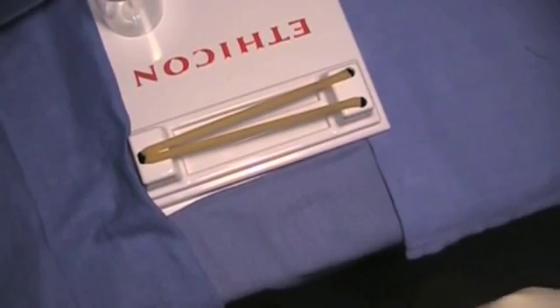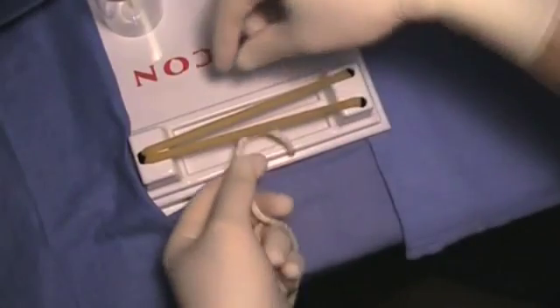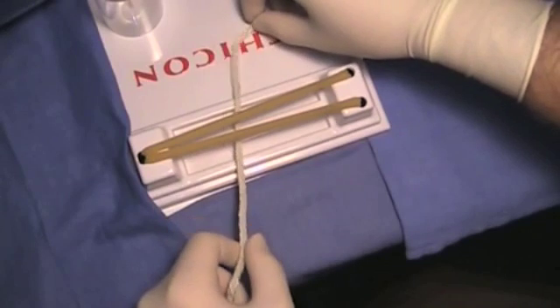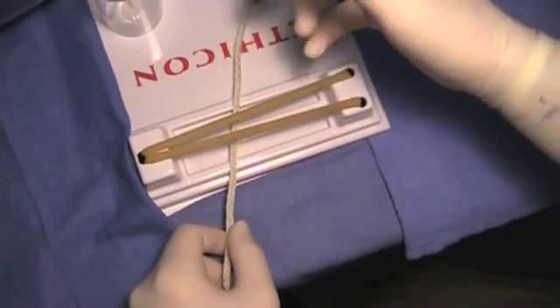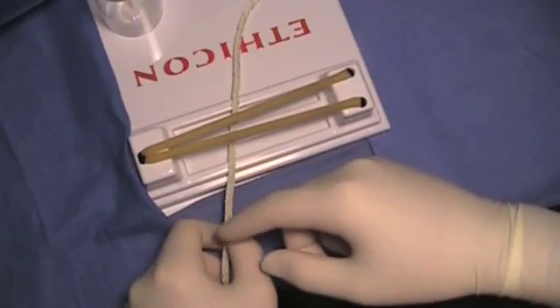The second component of the third year practical and the standard technique required for all third years is the two-handed square knot. We'll start for right-handers. The short end of your rope will be above the wound and in your right hand. The long end of the rope will be below the wound and in your left hand.